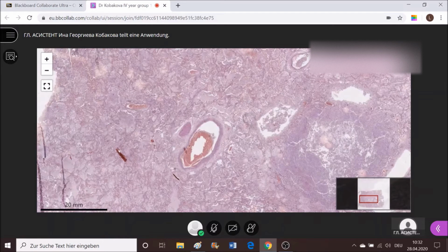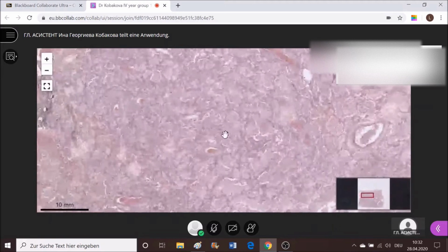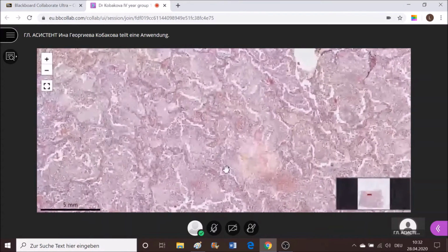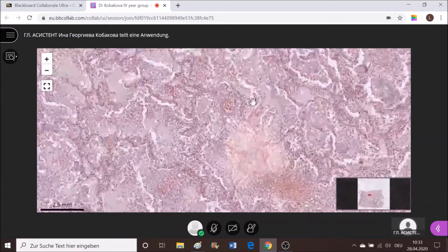Okay, I'm going to put a specific place of it on the screen, and one of you at least is going to give me a description of what you're able to be seeing, so that we will check up for mistakes of understanding. What do you see here?